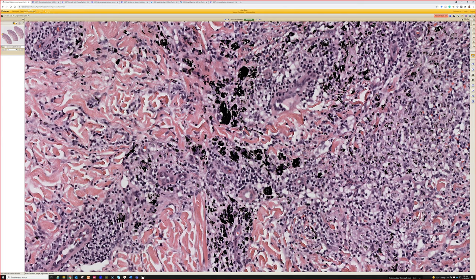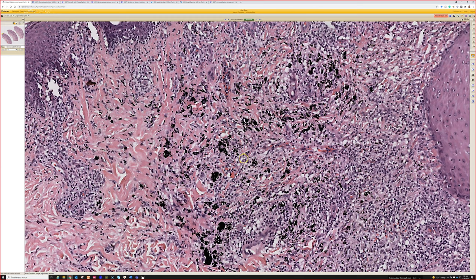It could be tattoo, or graphite from a pencil injury. If it's in the oral cavity, it could be amalgam or other metals. Metals usually look black microscopically. People who drink colloidal silver for dubious health benefit can get argyria and have blue skin that microscopically will have little tiny particles of black. So that's a really useful clue. A lot of people don't know that — I've heard of people saying they don't want to use black ink when inking a melanoma specimen because it might get confused, but melanoma is never going to be black microscopically — always brown.